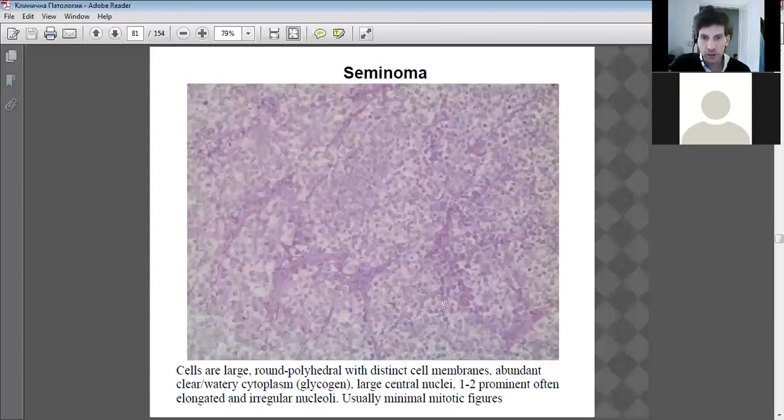Some are a bit abnormal, elongated there, not round as they should be. So in this slide, there's a bit of mitosis occurring. However, it's not exactly uniform. It's not normal. I can't see examples of any white blood cells in this magnified slide, though.